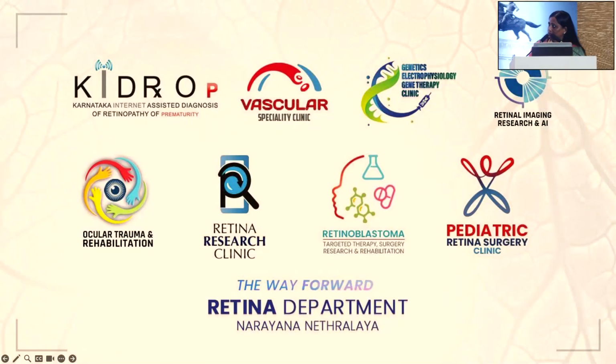Thank you, Aditi. It's a very tough task, 7 minutes, an entire OCT book virtually you have summarized, but I think you gave a lot of very good examples. But to sum up, I would like to say, whenever you are interpreting OCT, don't behave like super consultants and say edema plus and give injection. That's where most of us falter.